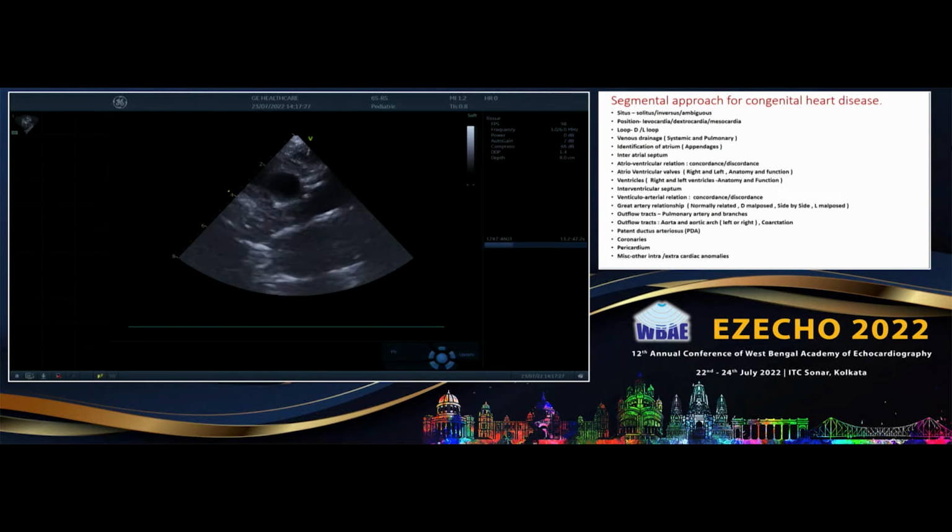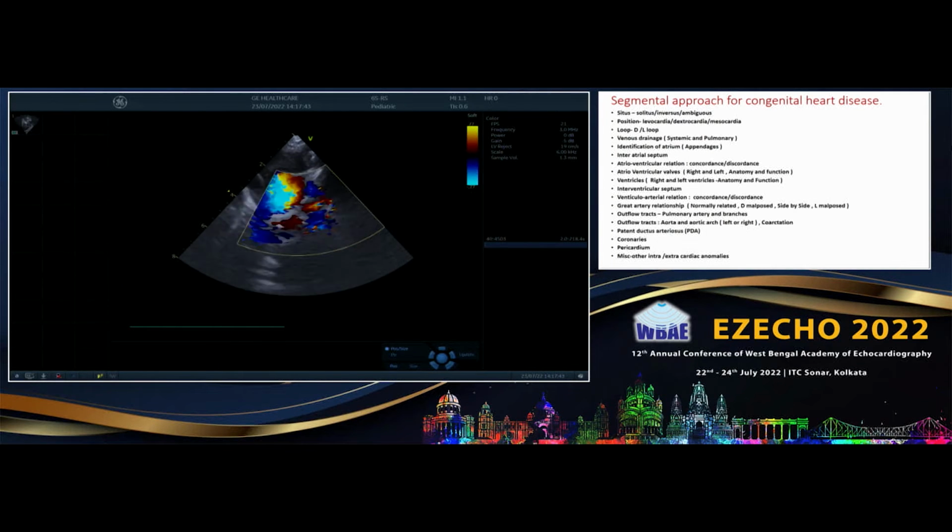This is the innominate vein coming, joining with the RSVC. You'll have to rotate. Yes, this is the RSVC, innominate vein, and then below it, this is the crab portion. Yes, she is showing it. RSVC, innominate. That is next baby will show.